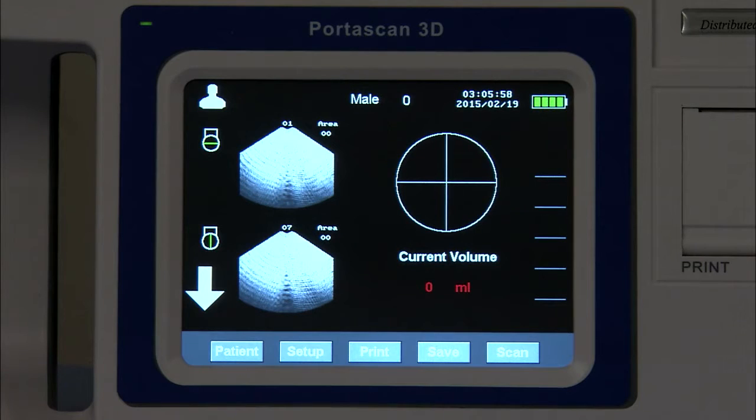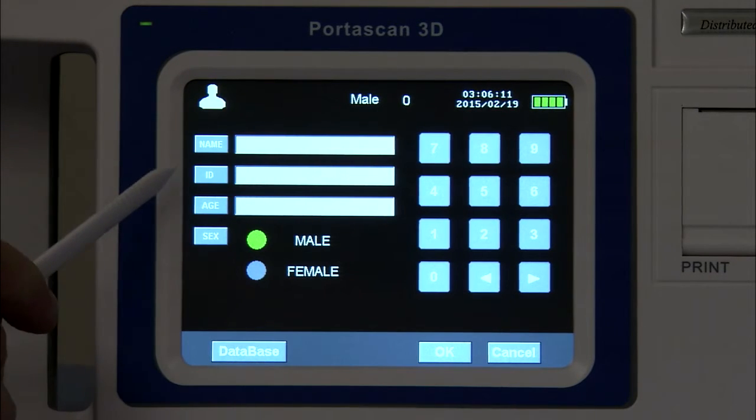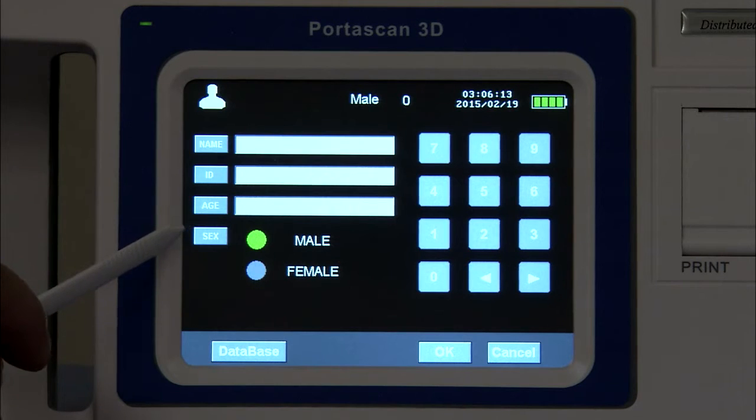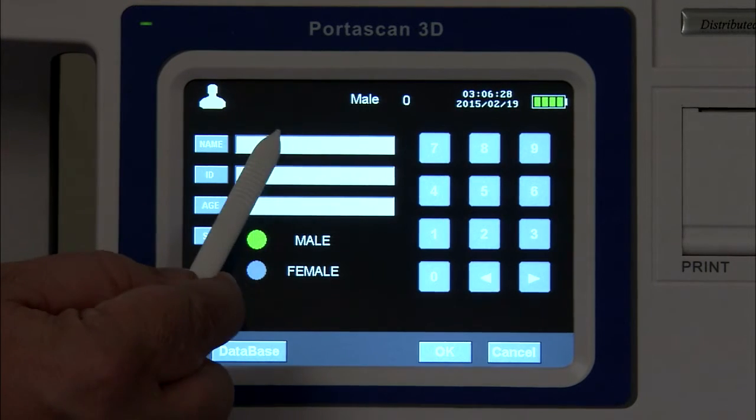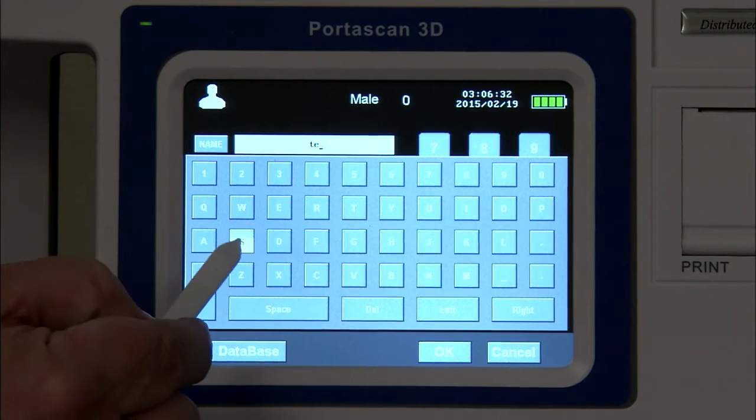Now that we have turned the machine on, there are a few features I would like to show you. As you'll notice, at the bottom of the screen there are multiple buttons. If you click on the patient button, it allows you to enter the patient name, ID, age, and sex. Enter your information in the system.